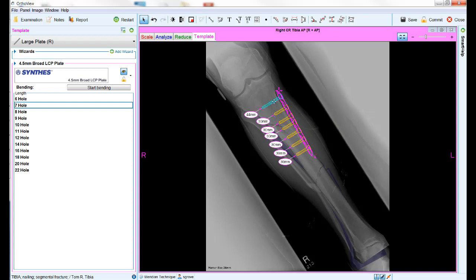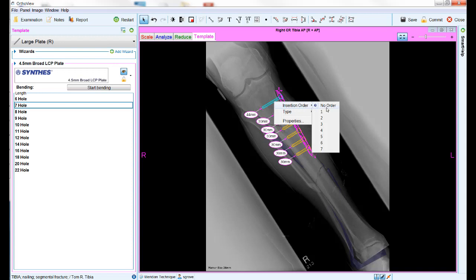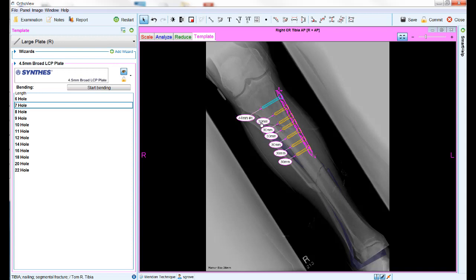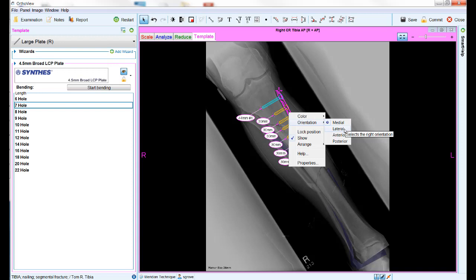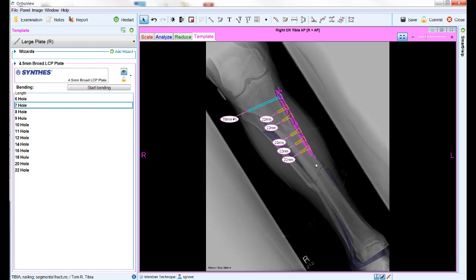The right click menu also provides the option to label the insertion order of the screws for reference during the procedure. Depending on the plate type, the right click menu may also provide the option of changing the orientation of the plate to medial, lateral, anterior, or posterior side of the bone.